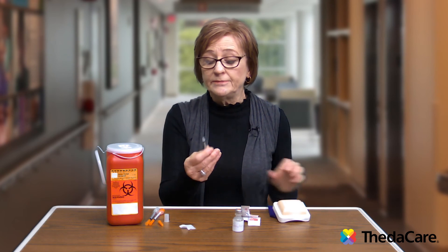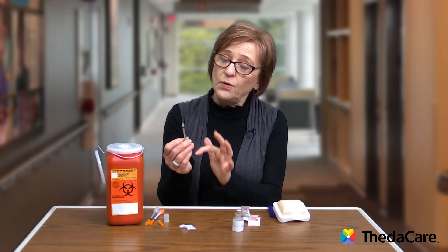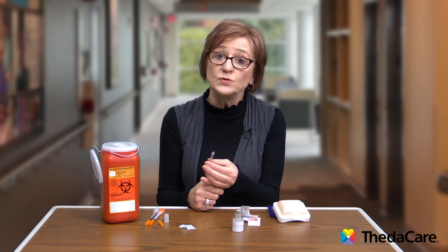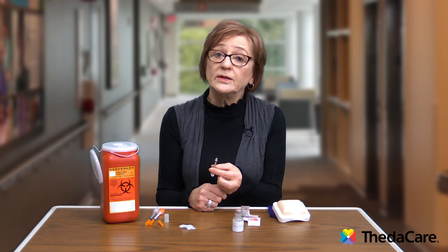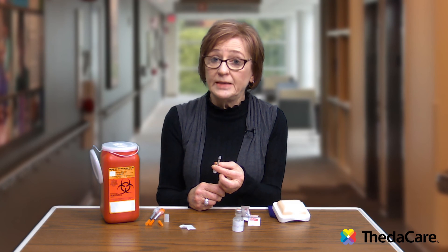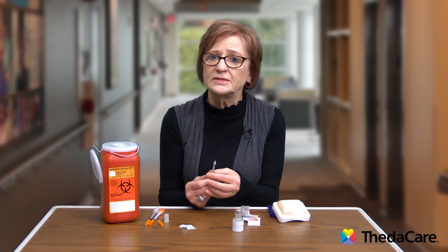For disposal of needles, don't bother putting a cap back on. It's best to throw the whole syringe into a specially marked sharps container, or a store-bought container available at most pharmacies or drug stores. If you make your own, it's recommended to use a heavy plastic bleach or detergent bottle with a screw cap, labeled 'sharps.' There are sharps collection stations where you can drop it off once it's full.